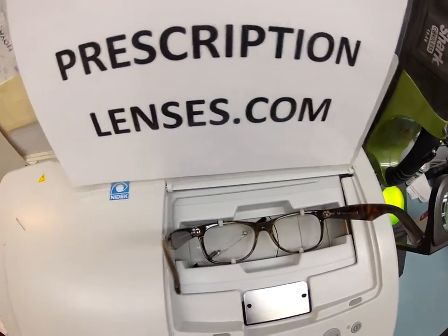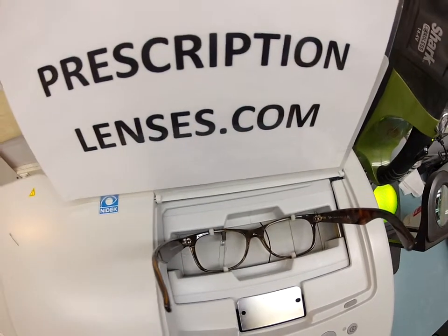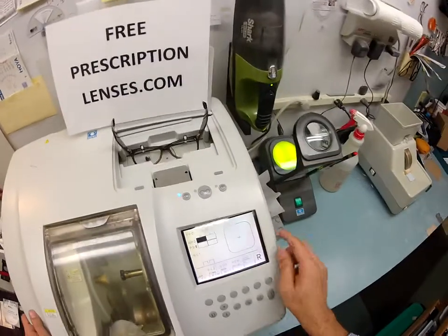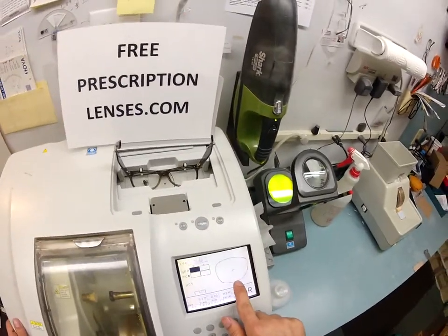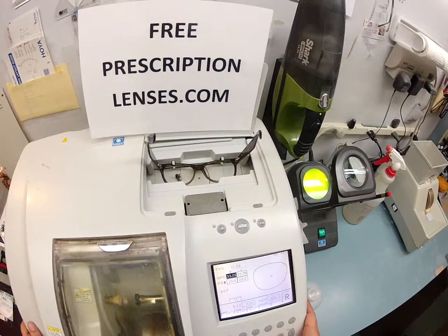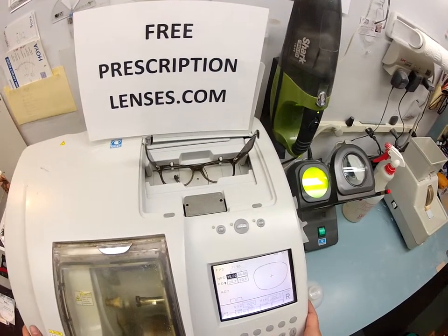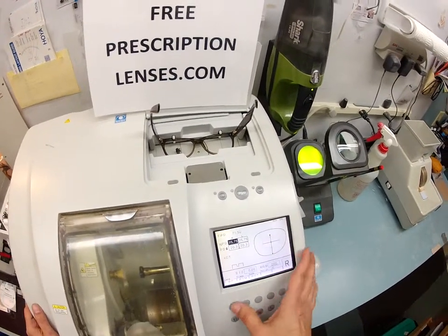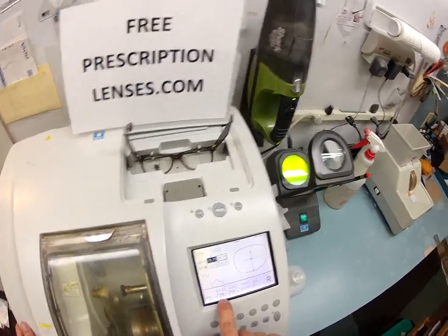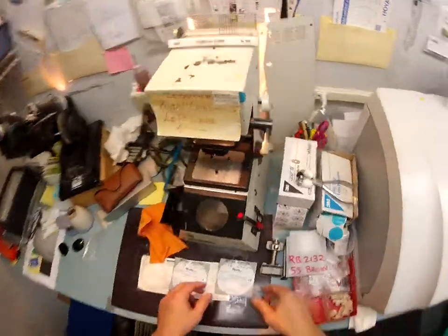So it has traced the right lens, it is now tracing the left lens, and pretty soon I'm going to pull your shape up onto the computer. So that is the shape of your right lens. If this were prescription, I'd put in your pupillary distance, but instead I'm going to match the frame PD. This is a polycarbonate lens being cut for a Zyl frame, which is an old school name for plastic.